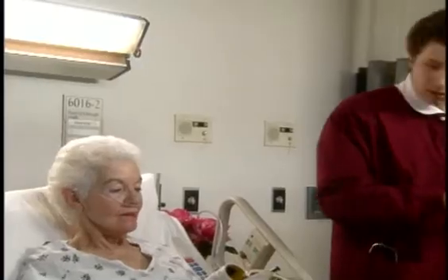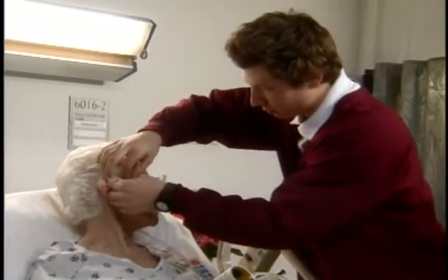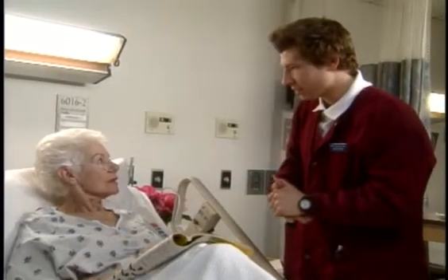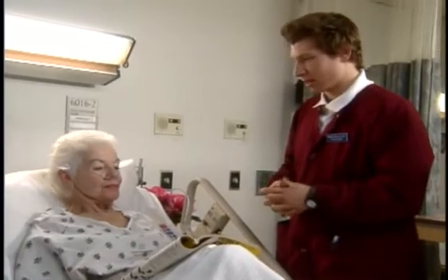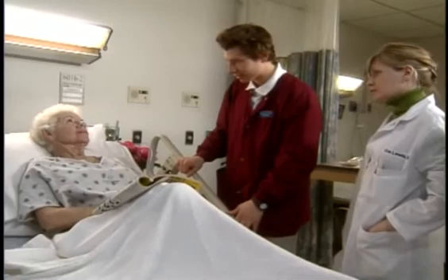Can you look towards me, Mrs. Keene? Thank you. All right. How's that feel? Oh, a custom model. Okay, Mrs. Keene, now just breathe through your nose with a closed mouth. Great. All right, wonderful. But everything else is okay? You're comfortable? I think I feel a little bit better now. All right, good, wonderful.